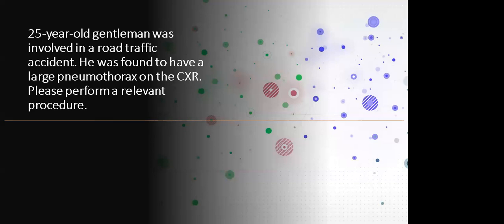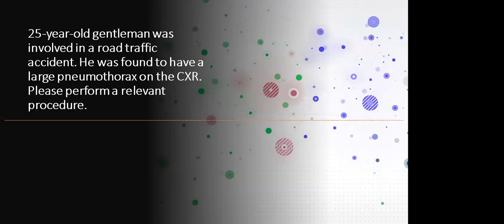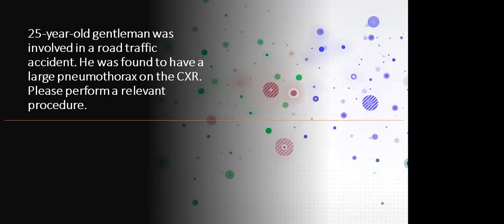Hi, good evening. I'm Dr. Srivanatha, treating doctor for you today. May I confirm your name and age? Hello, doctor. My name is John. I'm 25 years old. Okay, John. I have been asked to put a tube in your chest. Is that okay for you? Yes, doctor. Do you have any medicine allergies? No.